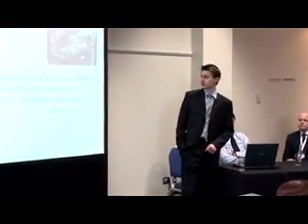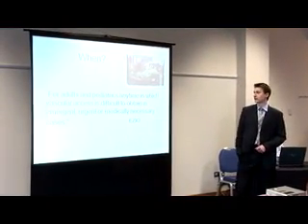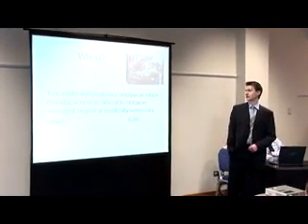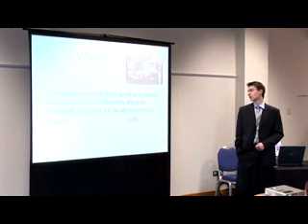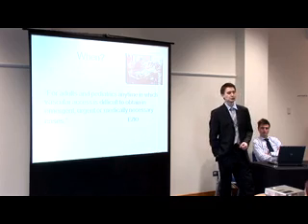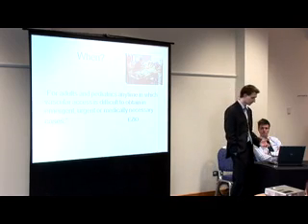The EZ-IO group, who make the EZ-IO drill, advocate it for adults and paediatrics any time in which vascular access is difficult to obtain in emergent, urgent, or medically necessary cases. So you've got someone who's acutely, severely unwell, and you can't get a venflon in quickly. What else are you going to do?